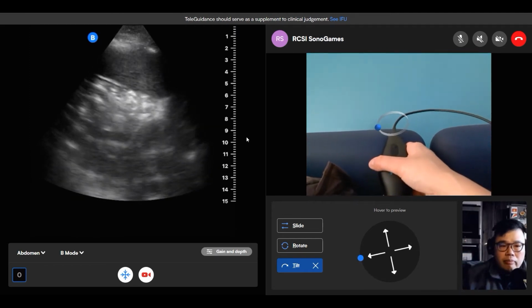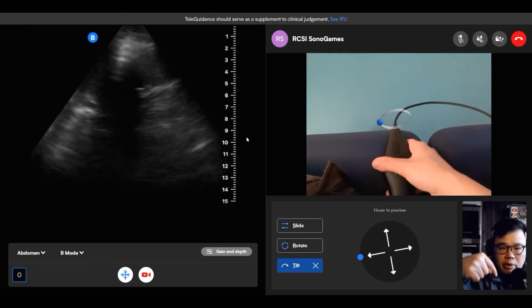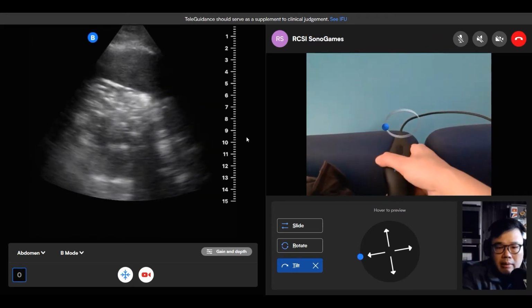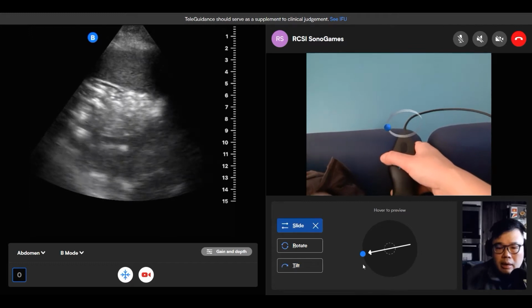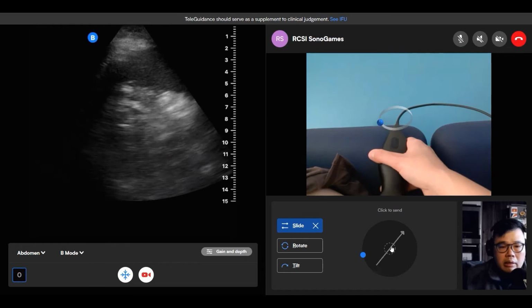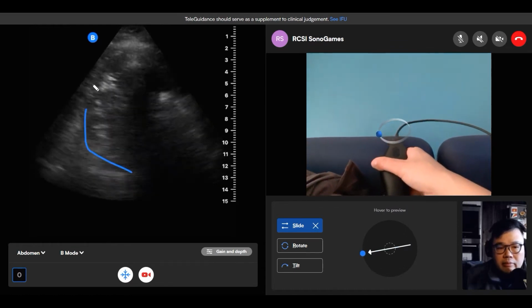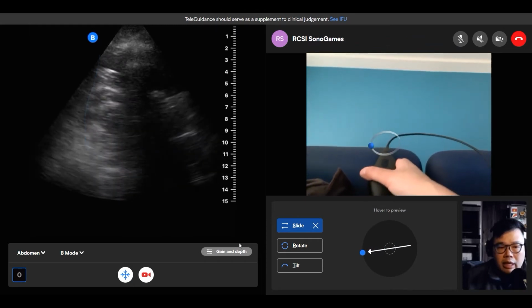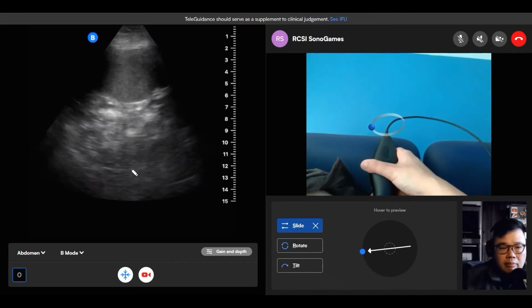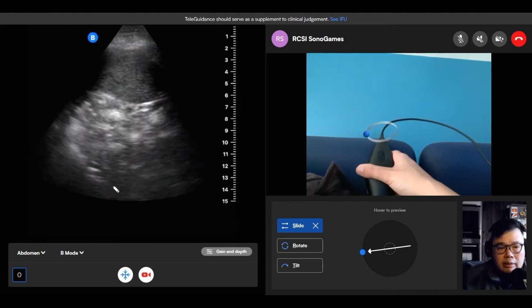Are you okay? Yeah, I know it's putting a lot of pressure. You don't necessarily have to exert a lot of pressure on him. You can exert the pressure on the bed, and then slide the probe up a little bit. Okay, slide up a little bit more. Okay, there you go. You saw the diaphragm there. There was this bright white line. So you can tilt back and forth to try and visualize that. There you go. So over there. Okay, I see what you're saying. Yeah, so you can see that there.